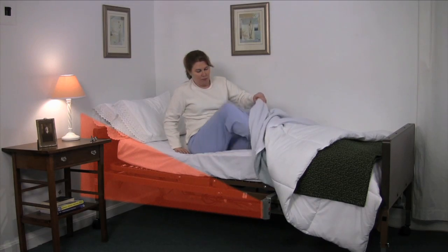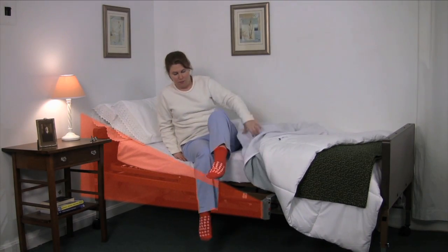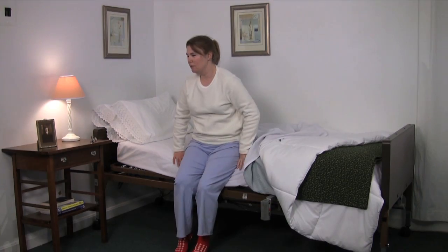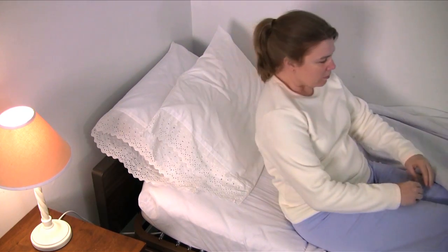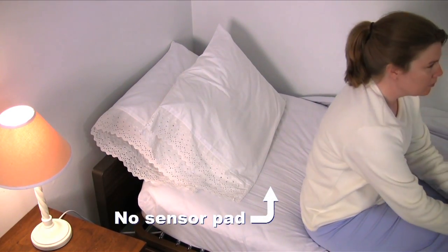There are several advantages PIR alarm systems have over traditional sensor devices. They generate early warnings to patients attempting to wander. They are wireless, so there's nothing to tangle or trip over. They are great for both infection control and incontinent patients because there are no sensor pads to clean.